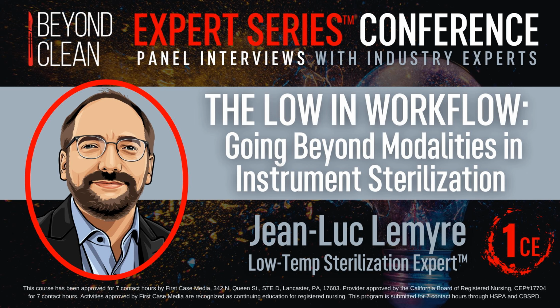If you've got too much water in there, the sterilizer may not reach the right pressure and just abort the cycle. Something else that can happen is that for water to go into the vapor phase requires energy. So water will take its energy wherever it can. It will either take energy from its surroundings, it could be the device or the packaging that the droplets are sitting on. In these cases, the surface temperature will go down significantly as they pass heat to the water to allow the water to go out. And in some cases, if the water droplet is sitting on a surface that is not a good heat conductor, the water itself will start to cool down, sometimes to the point that it will freeze, and you'll have some small pocket of ice on your load.